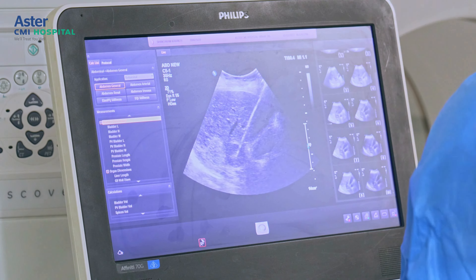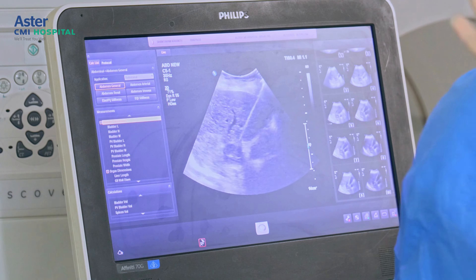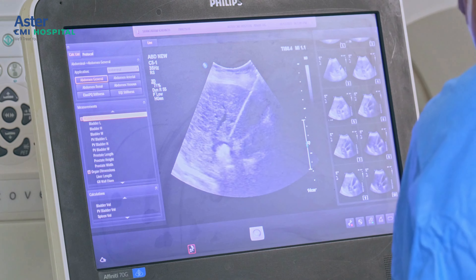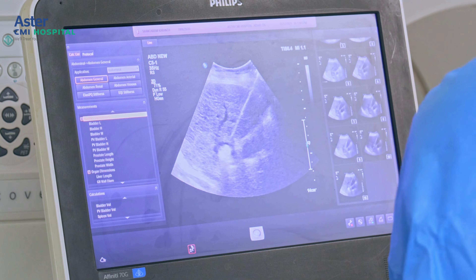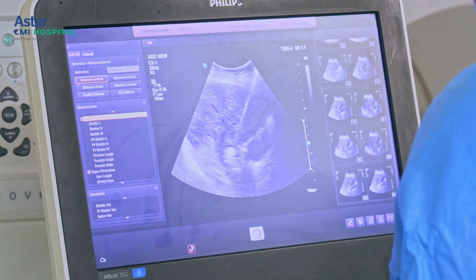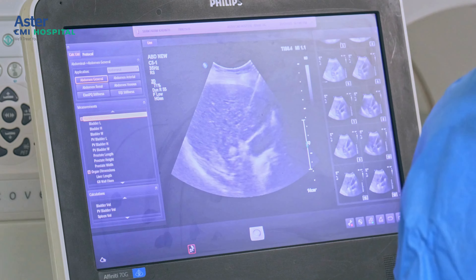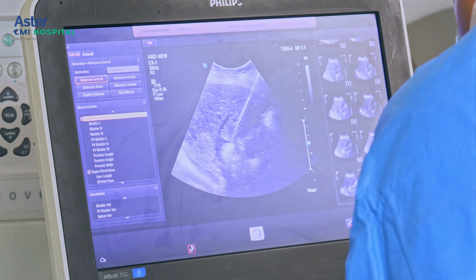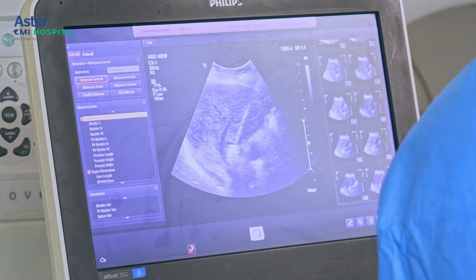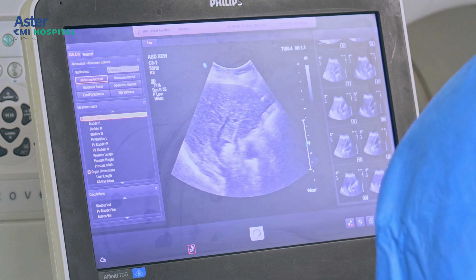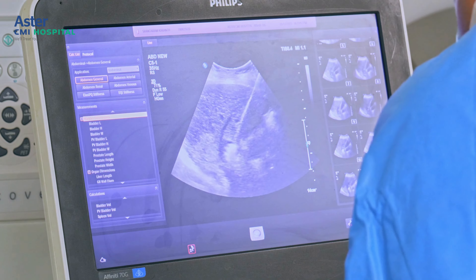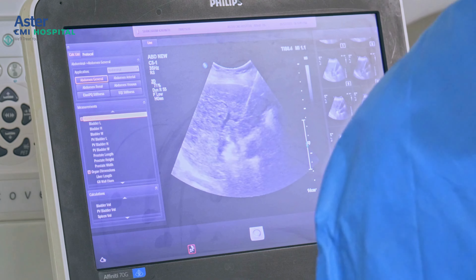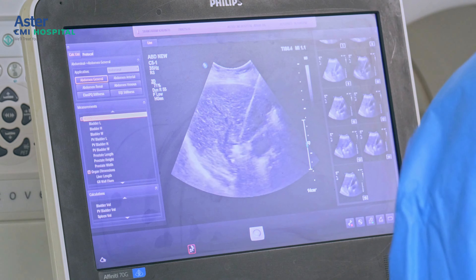The ablation has started. Post procedure, you will see the area completely replaced by a hyperechoic cloud once ablation is done. You can see the entire tumor almost becoming hyperechoic — that is the cloud we want to see. This hyperechoic cloud is basically tumor boiling. We see a good uniform cloud that we are able to appreciate now, slowly extending almost up to the margins. We can see the cloud cover completely engulfing the lesion. The tumor is not seen now — the entire thing has been replaced by the cloud cover. We are happy about the ablation.